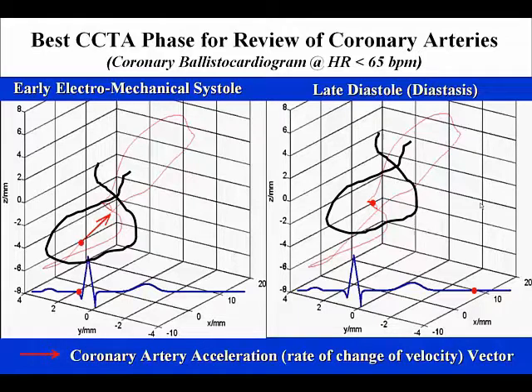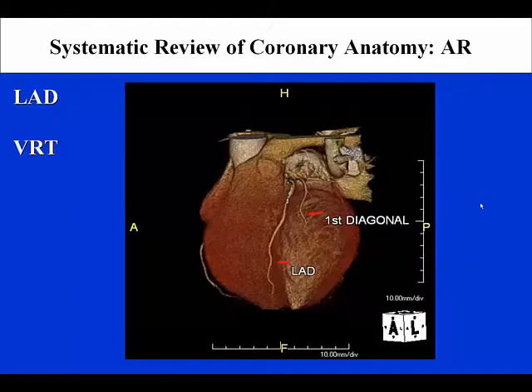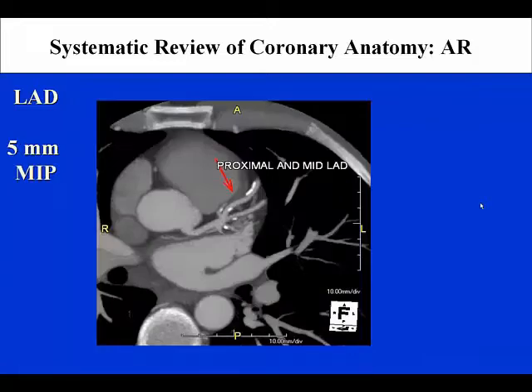Shown here are representative examples, beginning systematically with evaluation of the left main, showing it in the transaxial or foot view on the left and an anterior view on the right. You can see that the left main is normal. One can evaluate the left anterior descending using a variety of tools. This volume rendering demonstrates the length of the left anterior descending and a portion of the first diagonal branch. Shown here in a maximum intensity projection, we see the left anterior descending proximal and mid-segments, demonstrating eccentric coronary artery calcification in the LAD and in the first diagonal. These are eccentric and non-obstructive in nature.